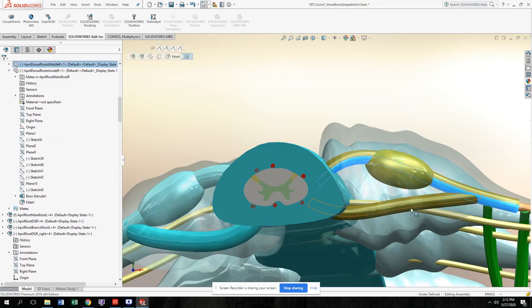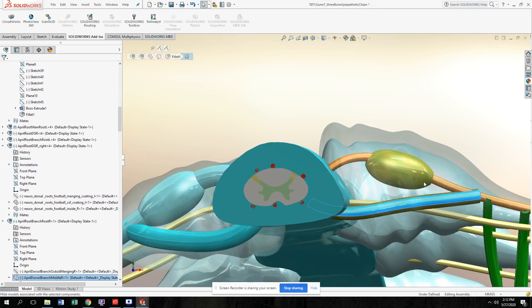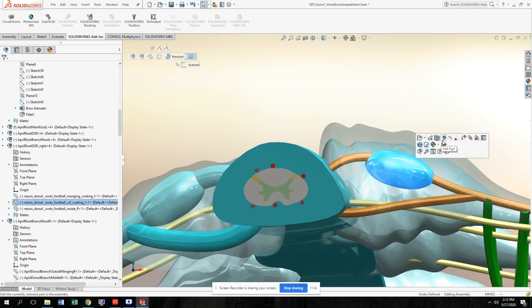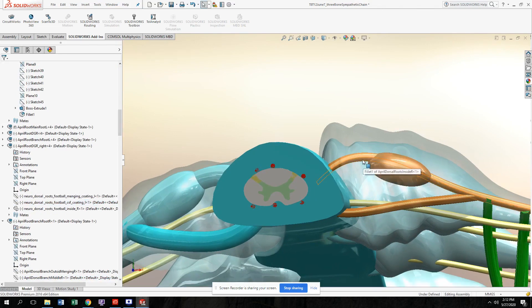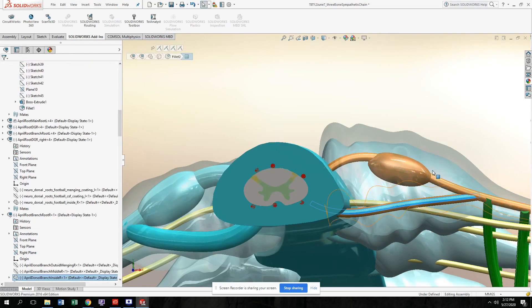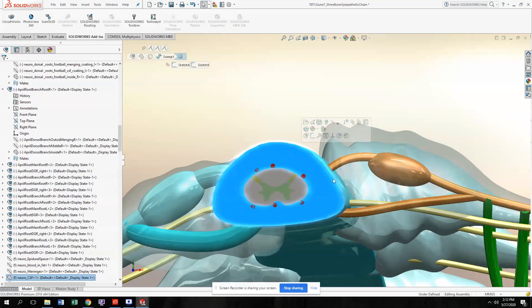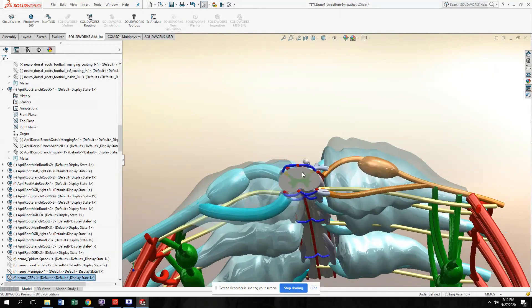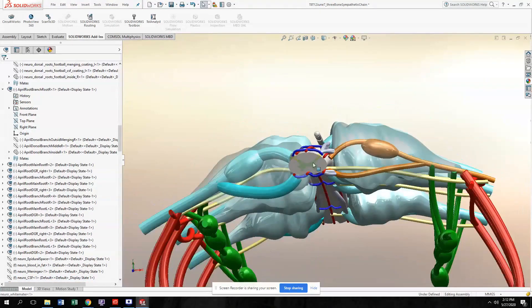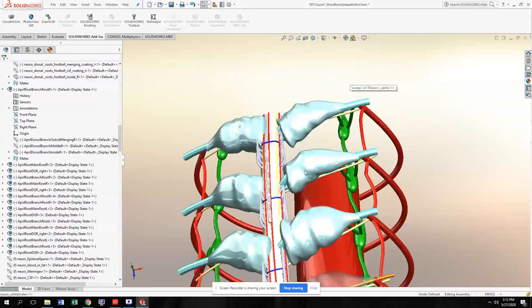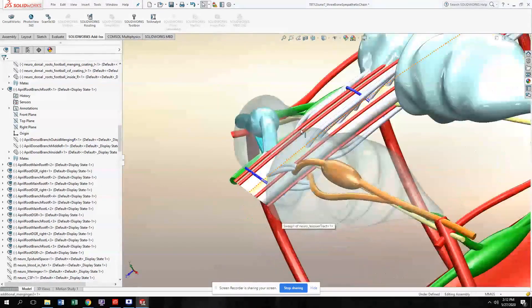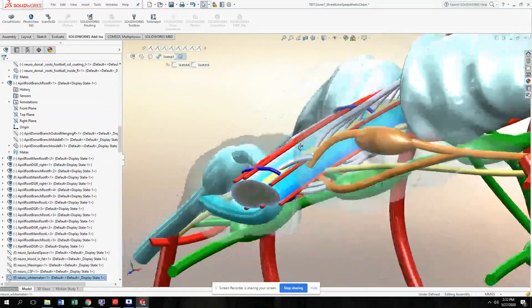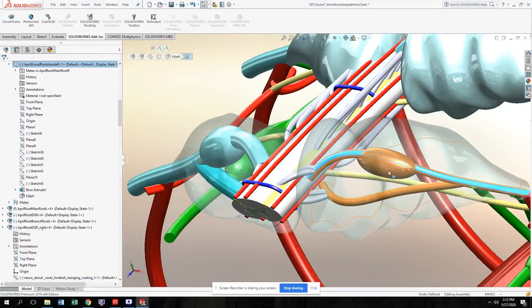This outer coating is the arachnoid matter. When I hide this, you see the final layer of meninges over the dorsal and ventral roots — this is the coating of the pia matter. If I hide the arachnoid layer and the CSF enclosed inside it, you will see the pia matter. This whole layer highlighted is the pia matter, and that's what covers the dorsal roots, ventral roots, and DRG.